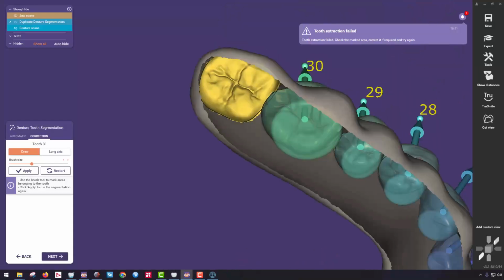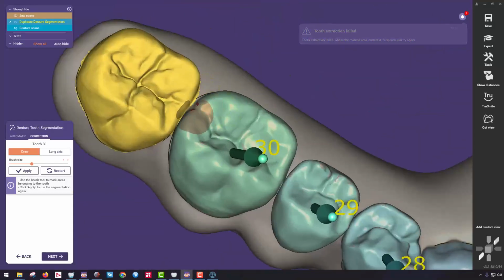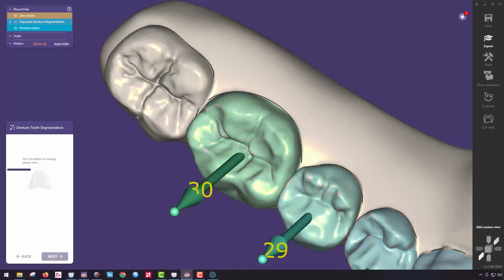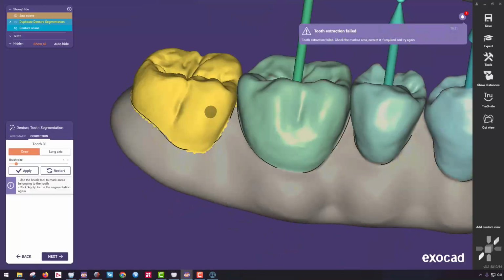If not, let's figure out what's overlapping right in here. And then turn my brush size on. It's like exocad knew that I wanted to wait till tooth number 31. Let me hit apply, see what happens. And then it fixed it. Great. So you can see here, you can use the tooling function.